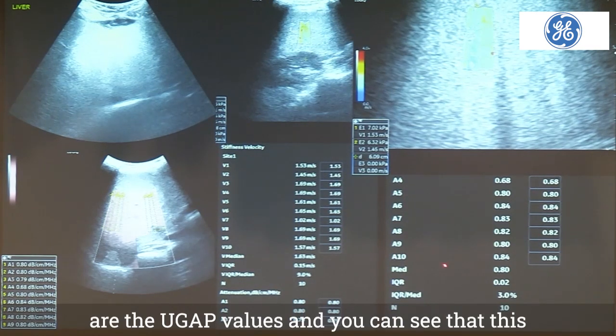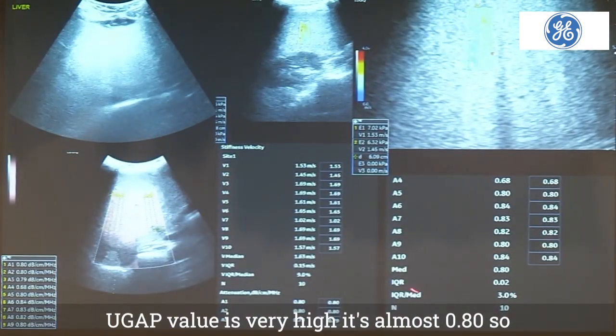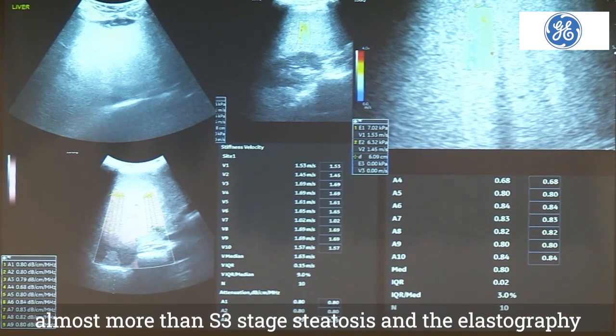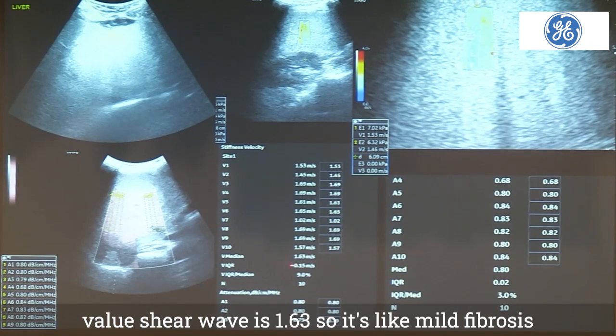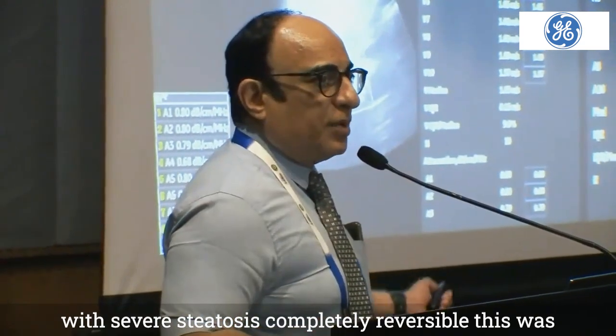These are the UGAP values, and you can see that this UGAP value is very high. It's almost 0.80, so almost more than S3 stage steatosis. And the elastography shear wave value is 1.63. So it's like mild fibrosis with severe steatosis, completely reversible.